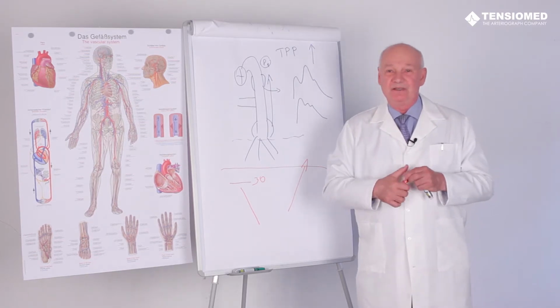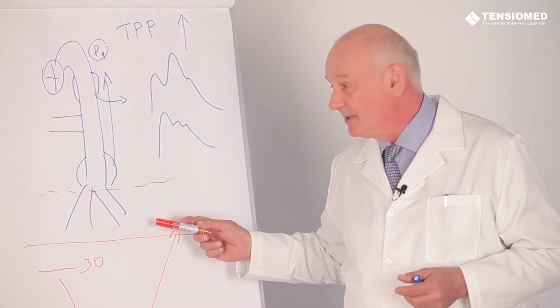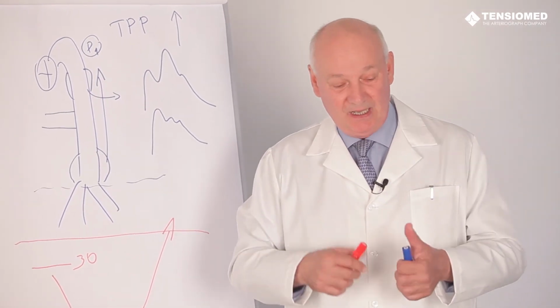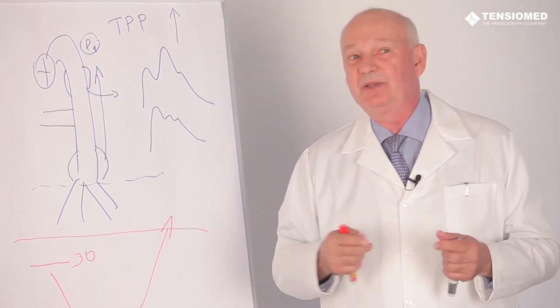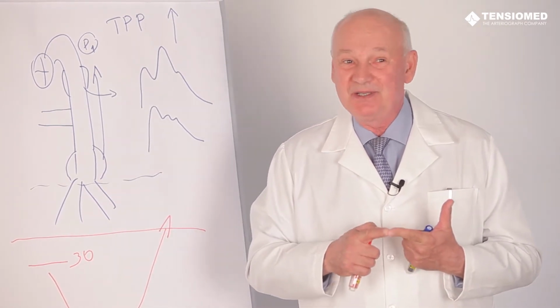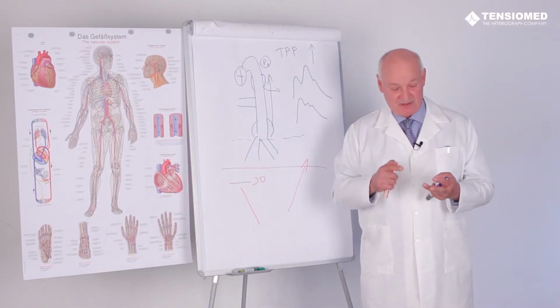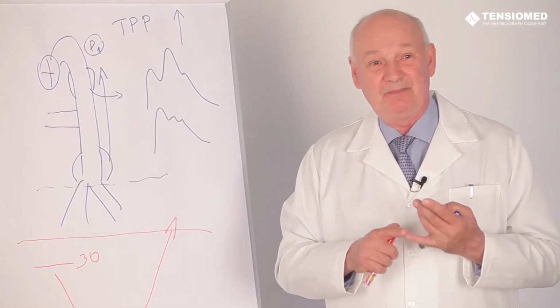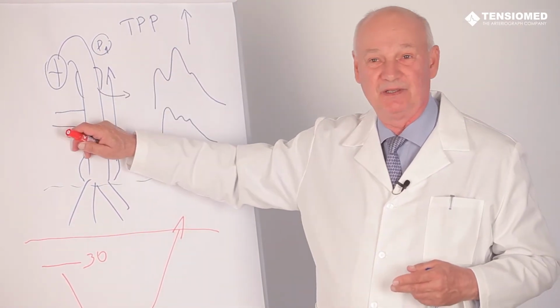Consequently, it is very, very important to standardize the measurement of the arterial function and the arterial parameters. Before the examination, the patient has to be informed not to come fasting. A small and light meal could be taken 2-3 hours before the examination. The patient cannot drink caffeine or smoke 3 hours before the examination. The patient cannot drink alcohol 10 hours before the examination. And the patient cannot sleep and cannot talk, because all of these influence the augmentation index.